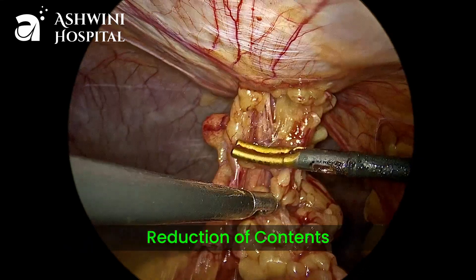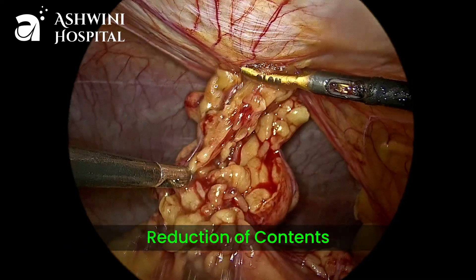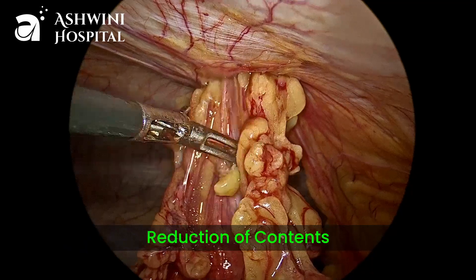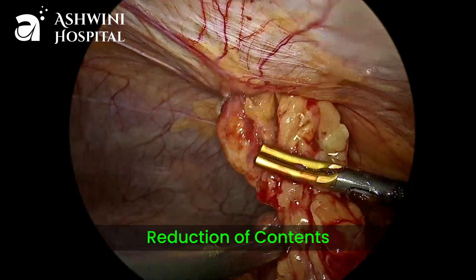We can use energy sources like bipolar, as in this case, or we can use harmonic or LigaSure for releasing the adhesions, or monopolar hook also.